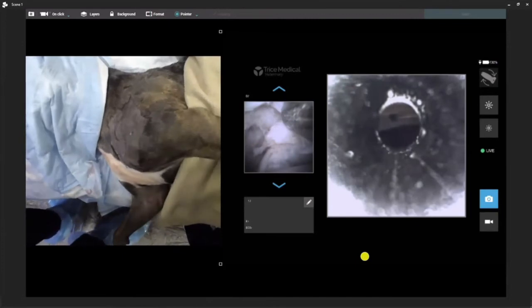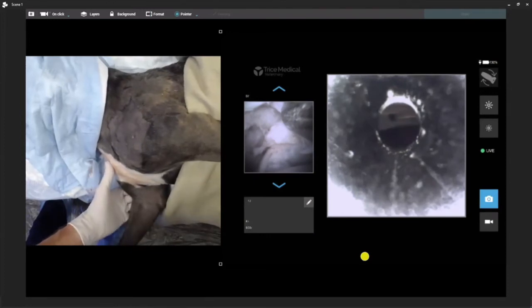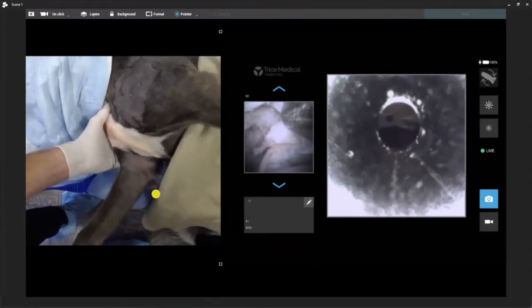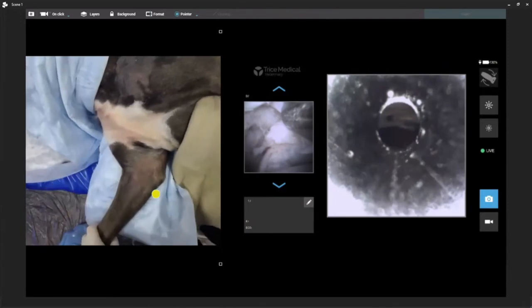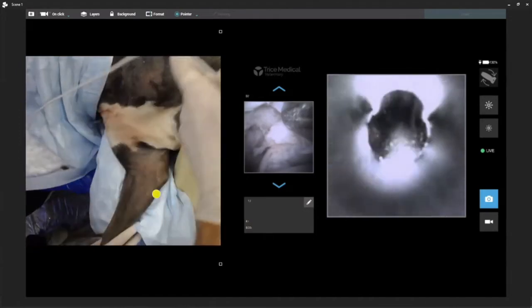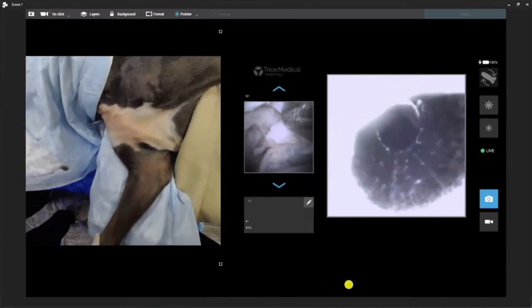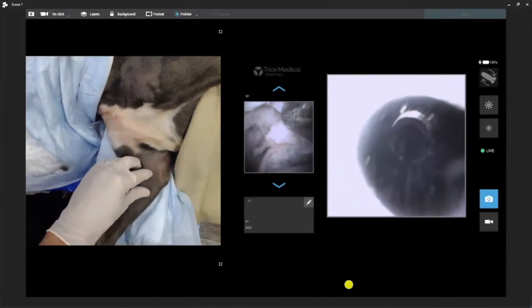Now we're going to do typical elbow placement. Lateral recumbency — we're going to go ahead and get a sandbag or some firm structure to place underneath the elbow. This will be your standard medial portal approach to the elbow. Once again, if this is something you're just doing for diagnostics — you suspect the dog has an FCP, elbow dysplasia, OCD, or any type of trauma to the elbow — this is something that can be diagnosed at the same time.